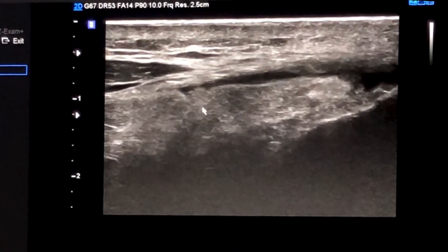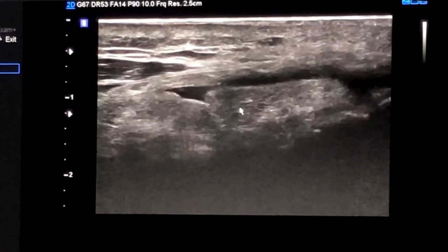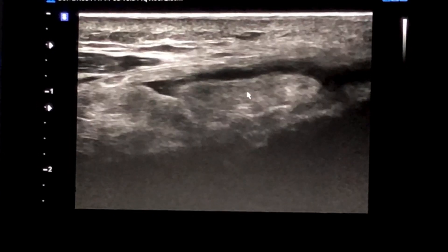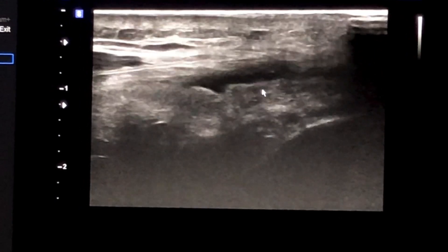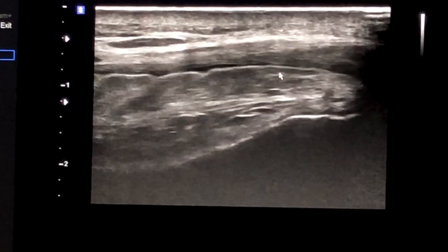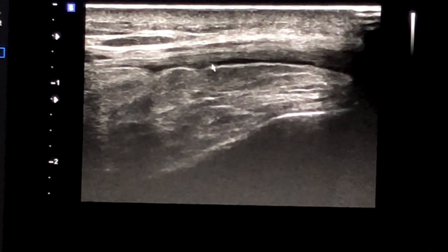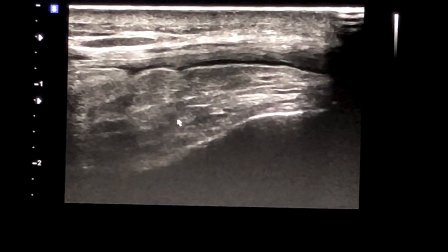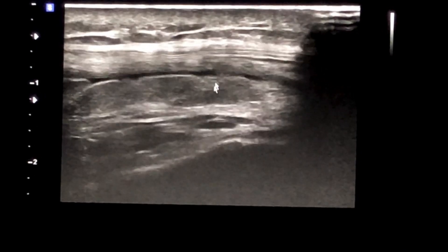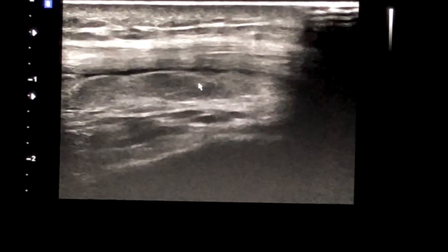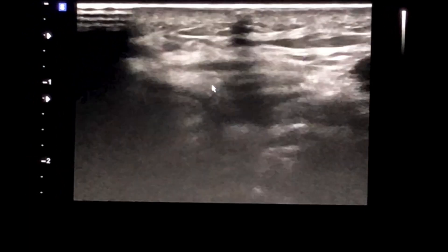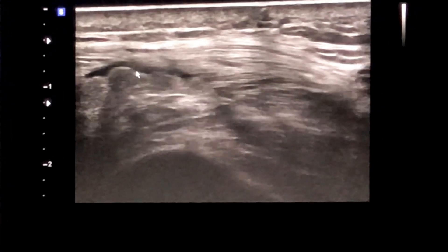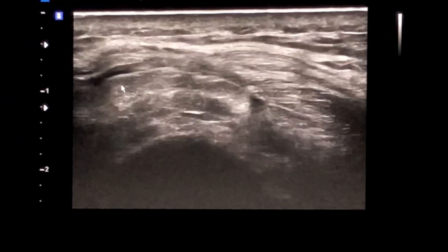Do you remember the slide in which I described that fat may be seen laterally in the recess? Fat has a smooth surface and is in direct continuity with the deep layers here. So the image you can see here may mimic synovitis, but it's not synovitis — it's just fat bulging within the lateral aspect of the suprapatellar recess.